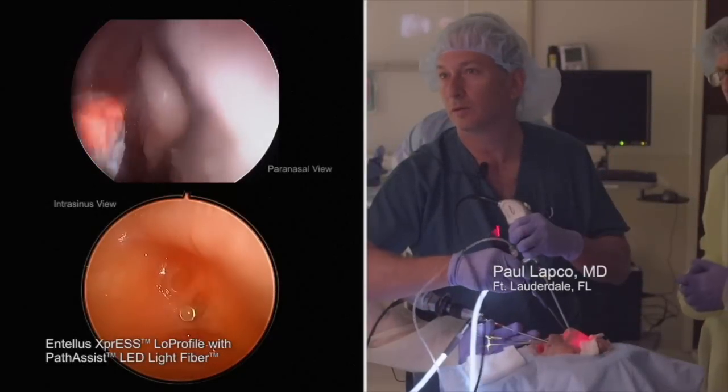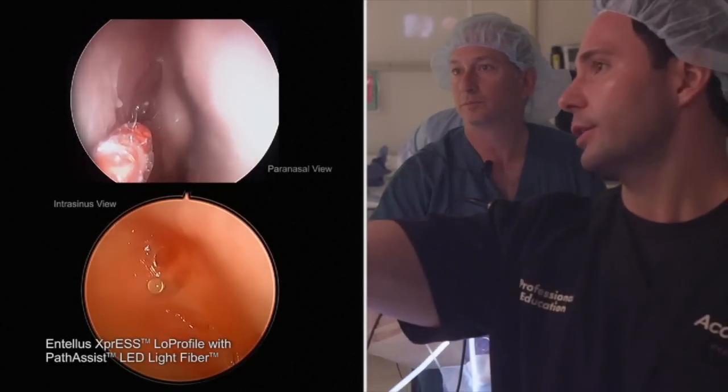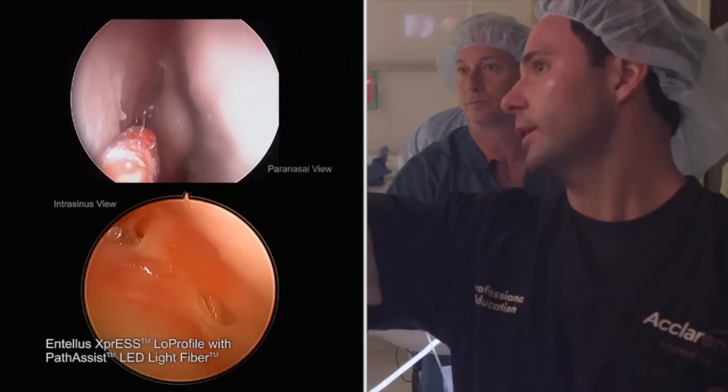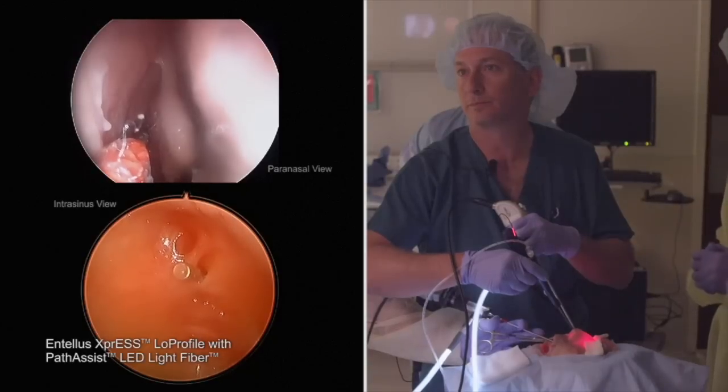Look at that — I'm in this way. So pull your scope back, Jeff. Did you see the false opening down there? Yeah. And that's the true opening — I heard that pop in.